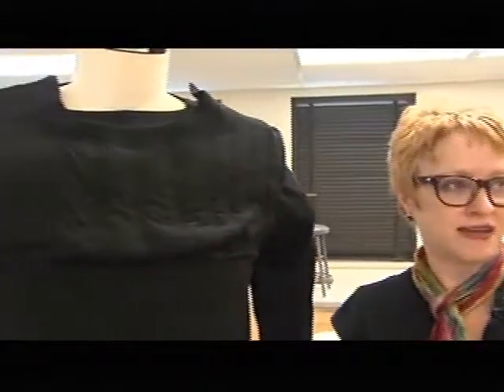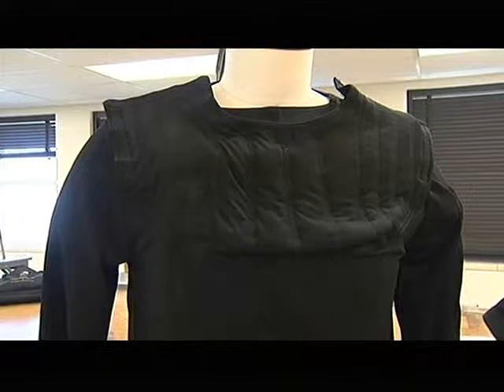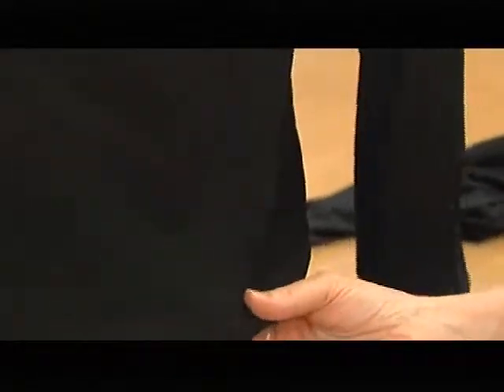So fashion design experts like Mary Rupert Stroescu from the Human Sciences Department were brought in to make a shirt to house the equipment. Her team had to consider which fabrics and threads would provide the best fit and function. They chose a stretchy polyester lycra fabric because it's comfortable and wicks away moisture. It also let them design around the need to attach heart monitoring electrodes to the body.